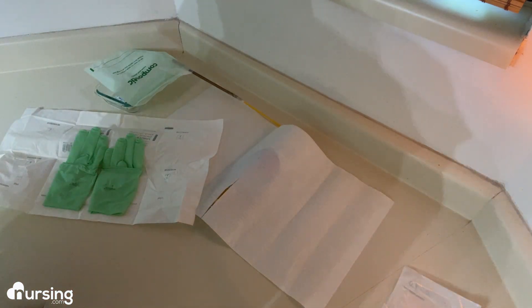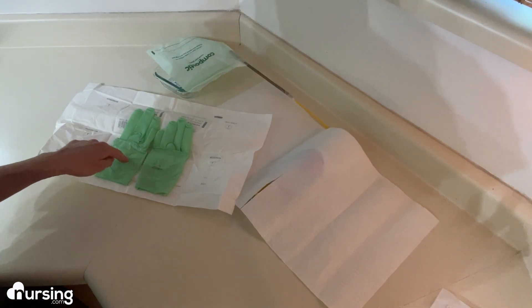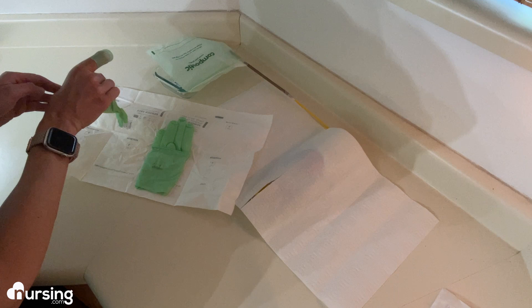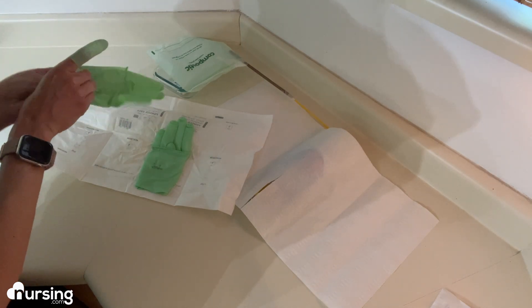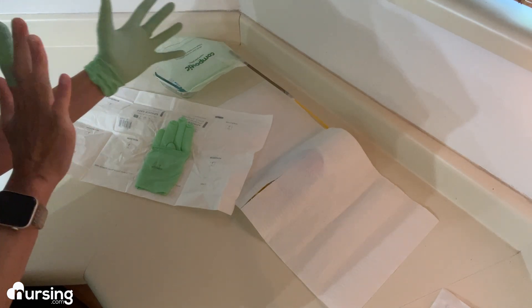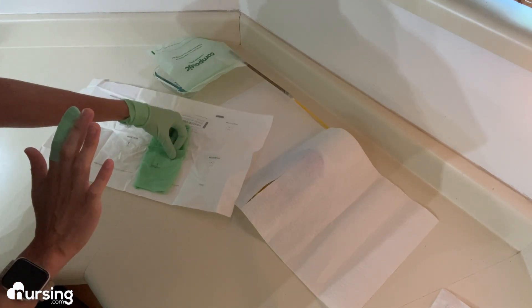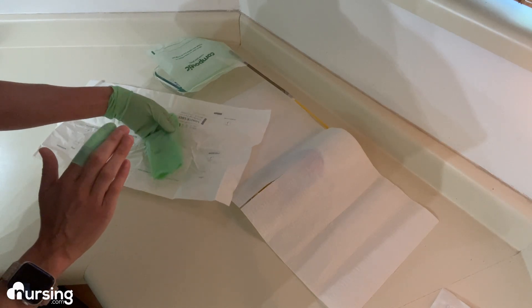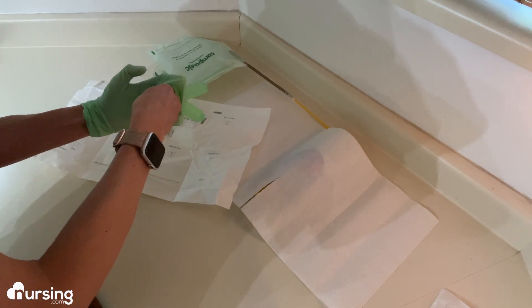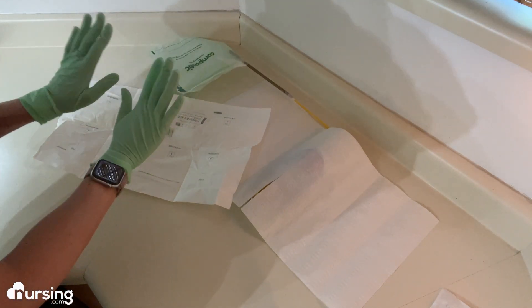Now I know that anything outside this line here is contaminated and not sterile. You'll want to don your gloves with your dominant hand first. Use your non-dominant hand to grab inside the cuff of the glove going on your dominant hand, apply the glove and get it on as much as you can, then leave it. Now use your dominant hand — still sterile — to grab inside the cuff of the other glove and place your hand inside that hole, making sure you're not touching the outside of that glove.